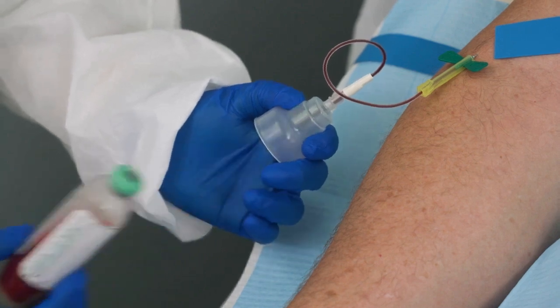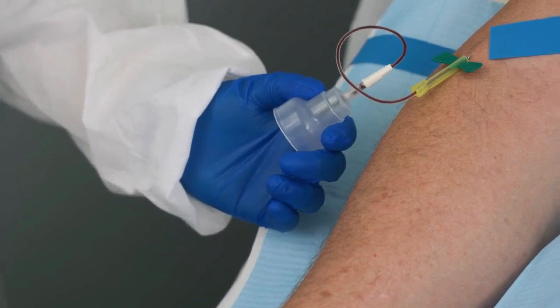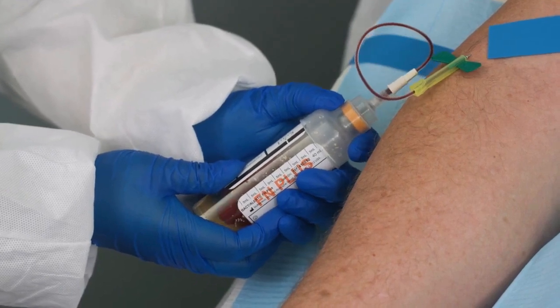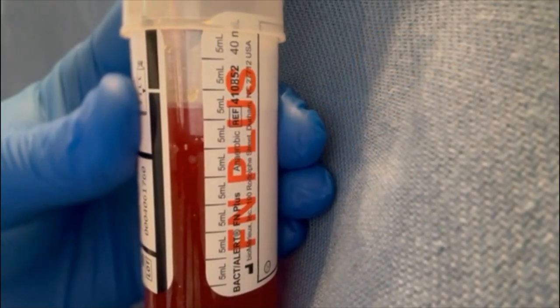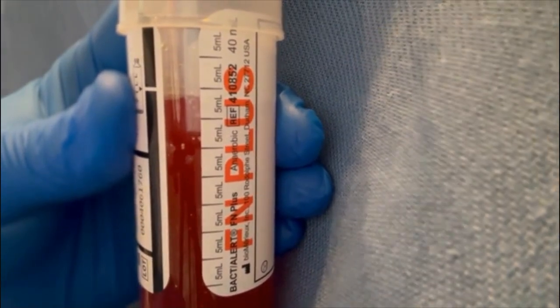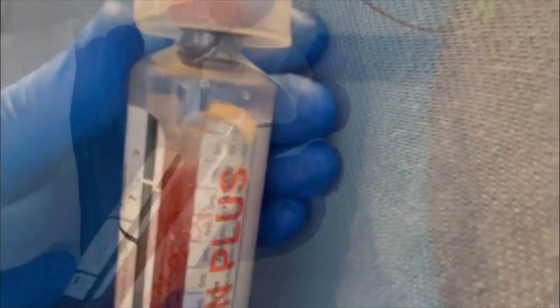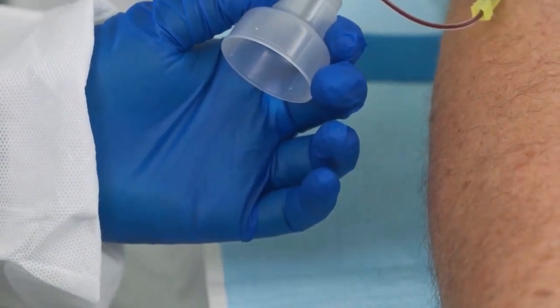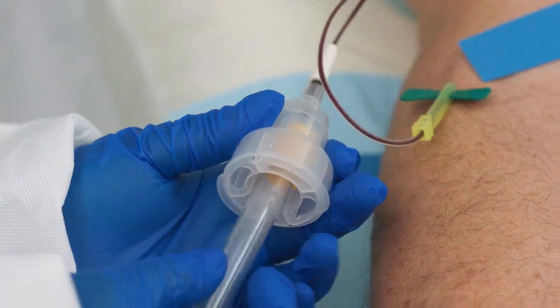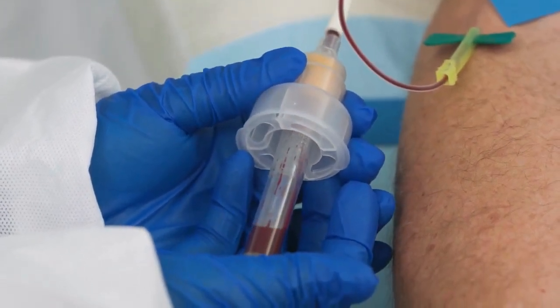Once the aerobic bottle has been inoculated, remove the bottle from the adapter cap. Insert the anaerobic bottle and repeat the collection procedure, using the fill-to mark to accurately gauge the sample volume — 10 milliliters per adult bottle. If other blood tests are required, always collect blood cultures first. Insert the adapter if required for blood tubes, taking caution not to put your finger into the center to avoid a needle stick.